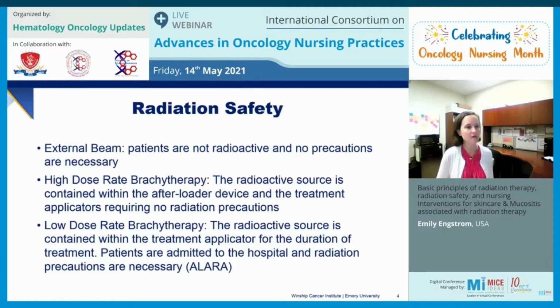We would time it so that we would know when to go back and retrieve those radioactive seeds. We would retrieve them and then remove the applicator, and the patient could go home. Again, they're not radioactive because we're taking those seeds out. But it did cause some level of dose to the staff when we did that.